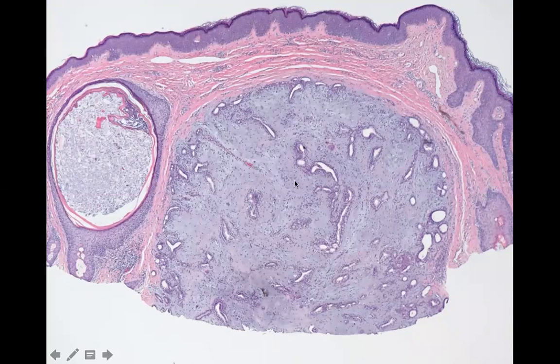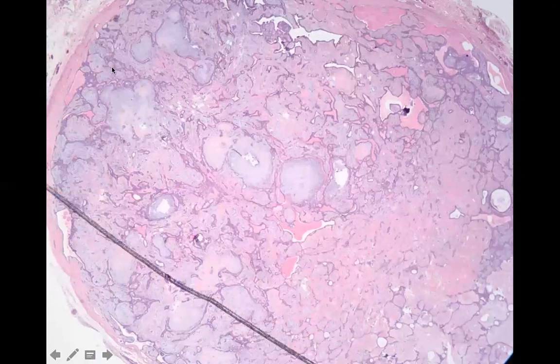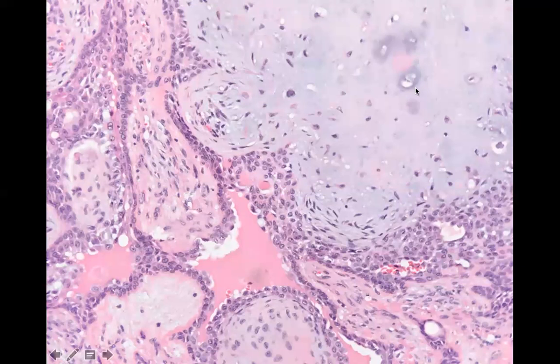So here, this is a mixed tumor. You can see a very prominent kind of bluish chondroid background, and then this ductal element that's elongated and branching. This is an apocrine mixed tumor, okay? And then this is another one. See, chondroid stroma. You see how well defined it is by its stroma? This is like a marker of being benign, this well-defined stroma. You see these ductal spaces making fluid, and they're elongated and branching. So this is another apocrine mixed tumor. Going in, you can see the stromal component and the ductal component. See the fluid, the chondroid stuff, little decapitation secretion.